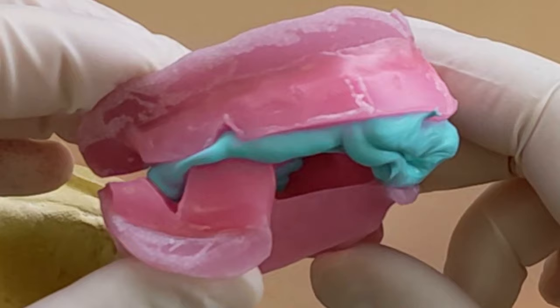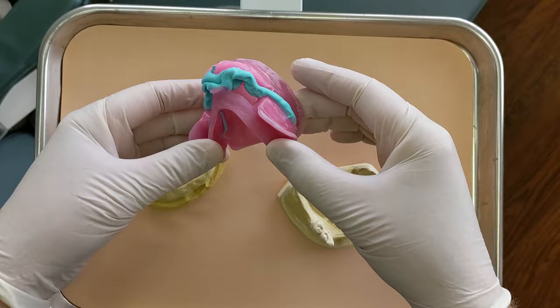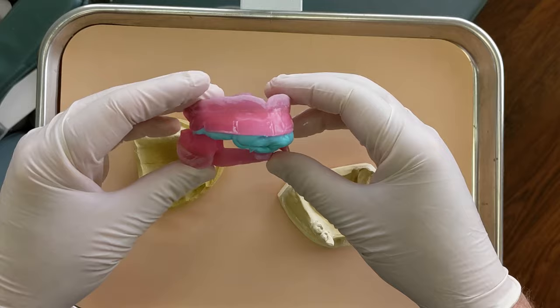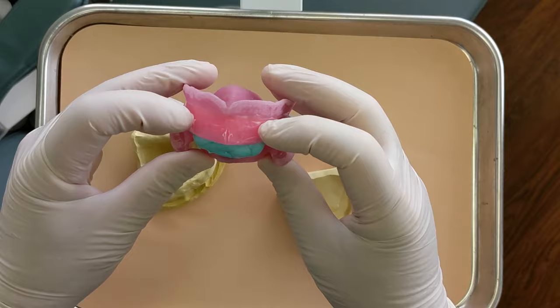Now that we have the bite registration, here's a close-up look at it. Lower wax rim, upper wax rim, and the blue material is the Blue Moose bite registration material — a very rigid polyvinyl siloxane that once set is hard and won't flex or distort. You can see where I marked the midline, which mostly corresponds to the muscle attachment, and then the width of the nose. I always like to mark that for the lab so it gives them an idea of where to set the front teeth.